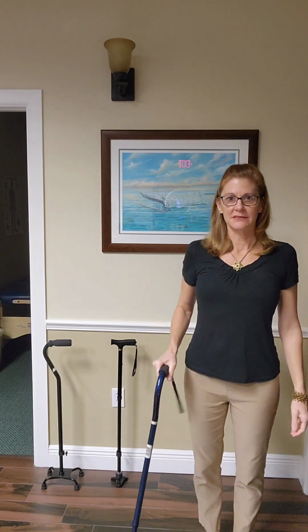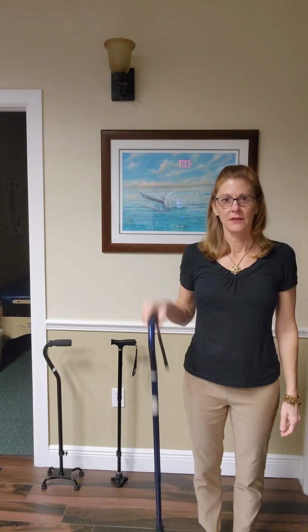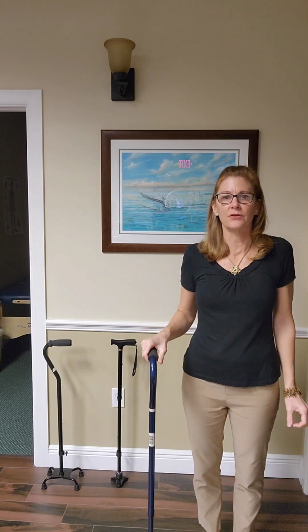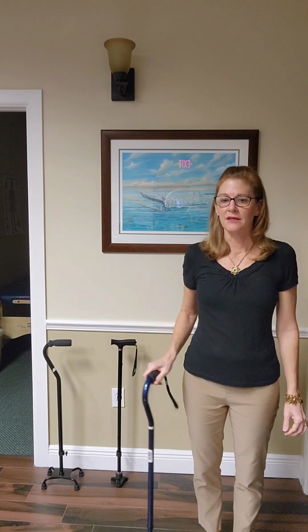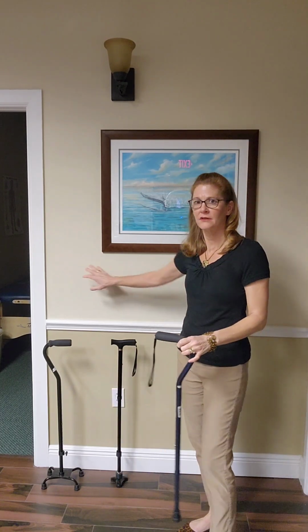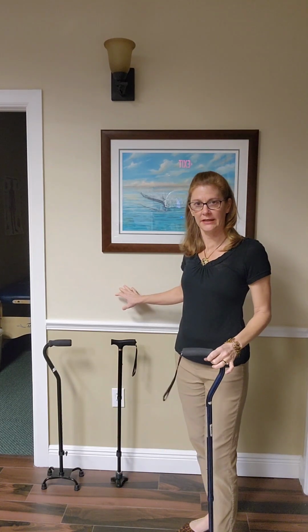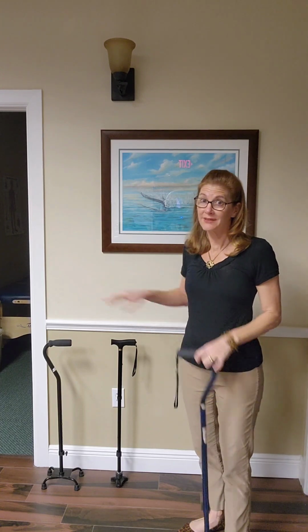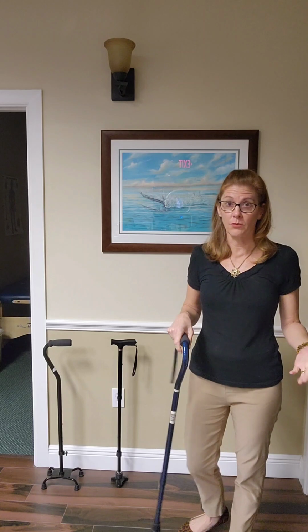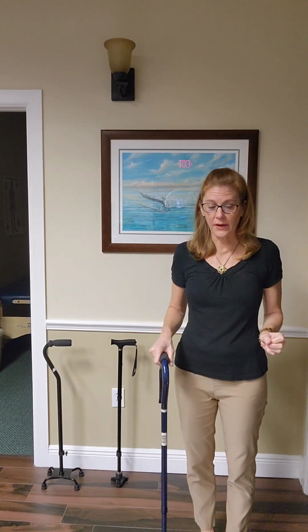Remember when I said that balance is a sense? The use of the cane for most people when they are using it purely for balance is just for the sense of touch. Just like touching walls, you don't have to press hard usually. If you do, that means the cane's probably not enough support for you. And we'll talk about a walker at some point.